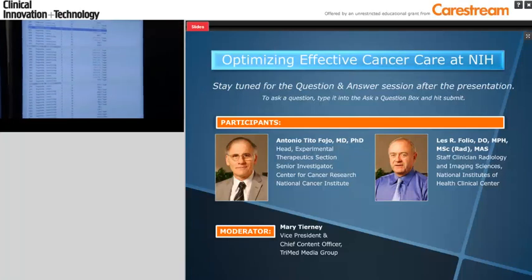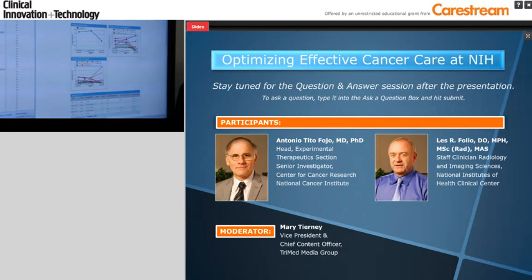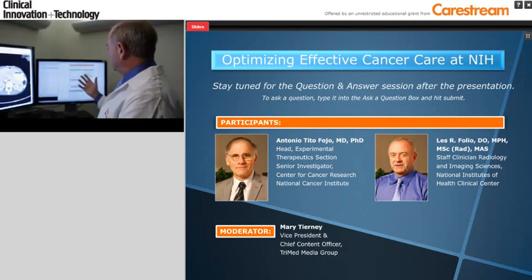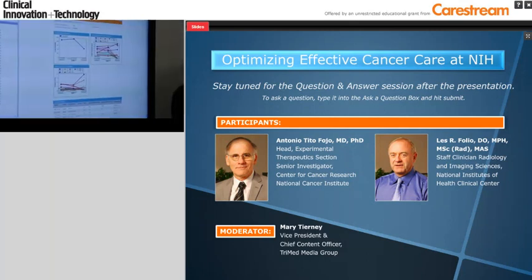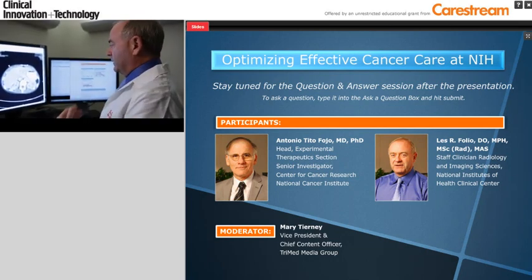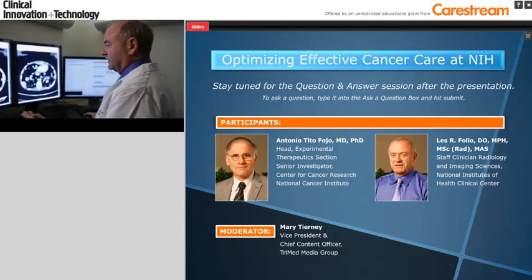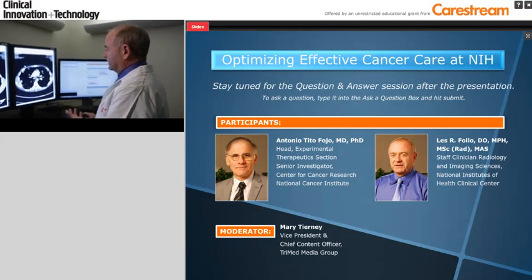Now I can just go to the Report tab, and this is after I've already done my qualitative assessment and my dictation. Now I can plot the points of all the various lesions that we've looked at, and some are getting bigger, some are getting smaller. These numbers will then determine whether or not the therapy is working over time, because it's just a monumental task for a radiologist or oncologist to look at this metastatic disease, which you can tell is very troublesome.